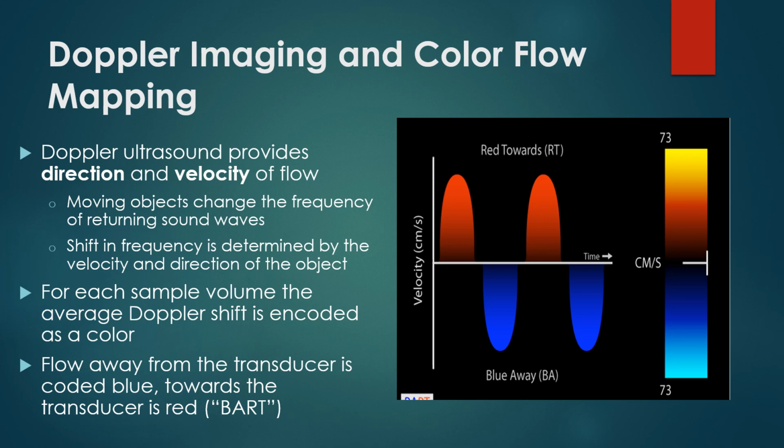And it gets kind of confusing if you've been doing a little bit of cardiac, or you've been around some transesophageal echo, you see mitral regurgitation always colored as red, so you think red equals regurg. Well, that's not the case at all, especially in transthoracic echo, because you're looking, especially in an apical four-chamber, mitral regurgitation is going to actually be blue because it's away from the transducer, which is on the skin. So instead of an inside-out measurement that you get with TEE, it's outside in. So you have a different color flow pattern.